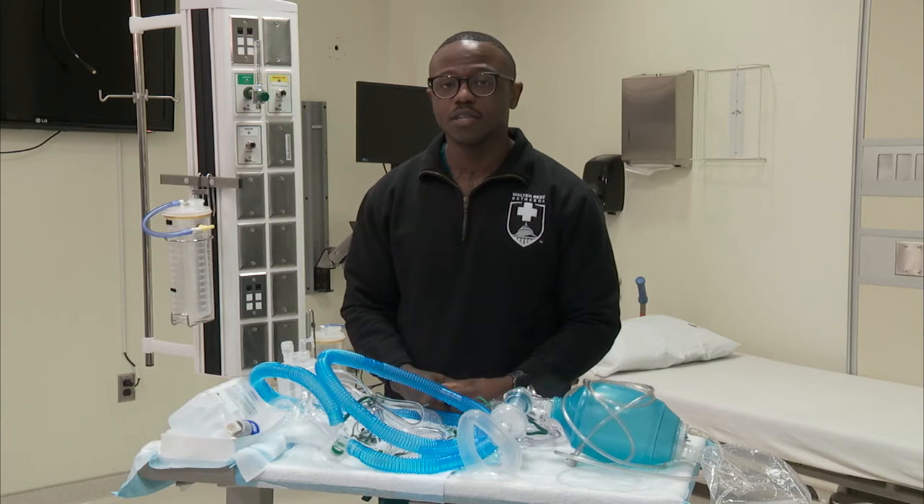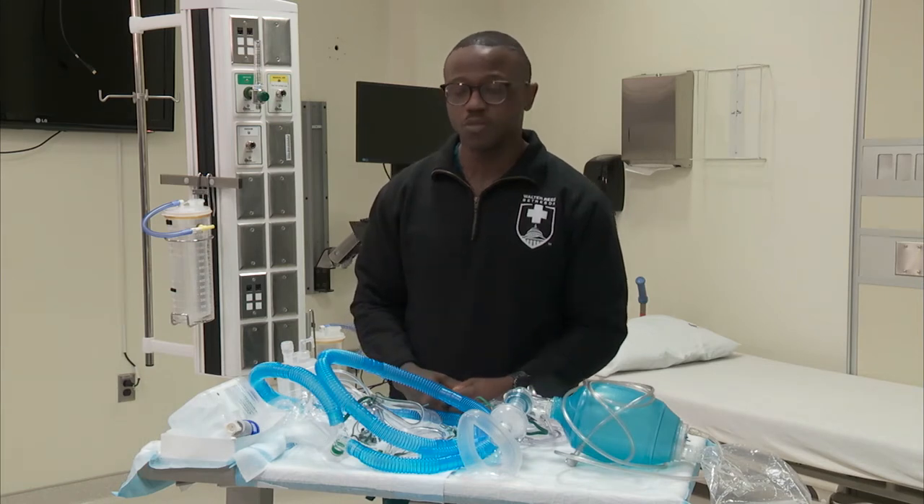Hi everyone, it's HM1 Dahl RT here at Walter Reed. In this video, I'm going to be going over some of our common oxygen delivery systems here at Walter Reed.